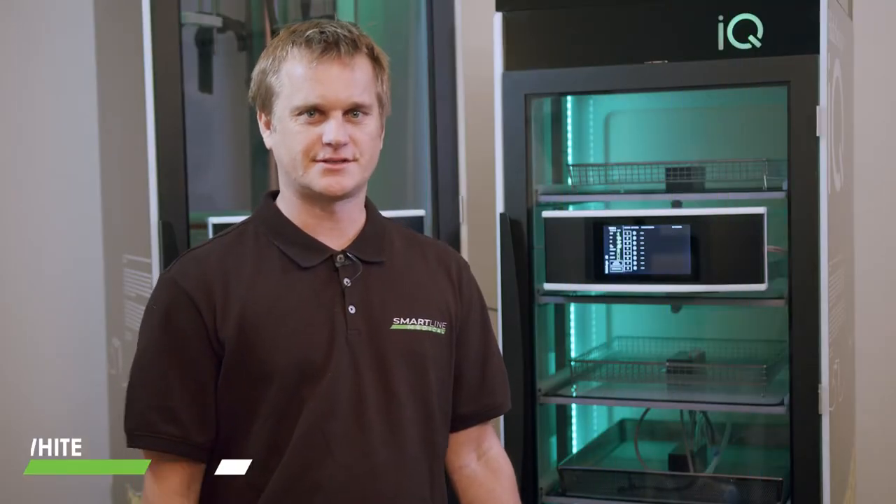When the cabinet presents in blue, it means it's time to clean the cabinet. You've got 24 hours to do so before it becomes a problem and it goes into a red state.